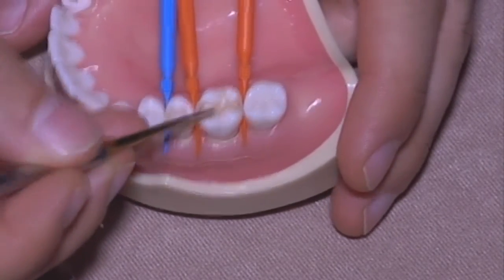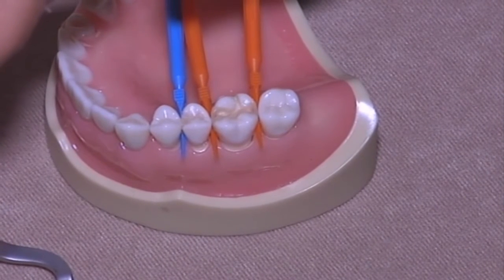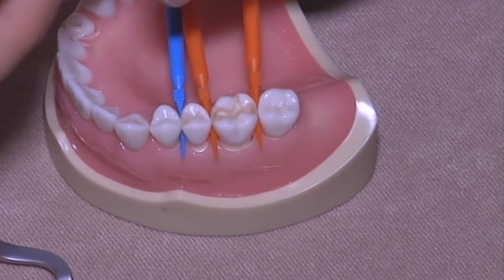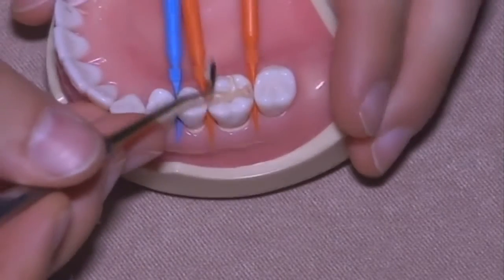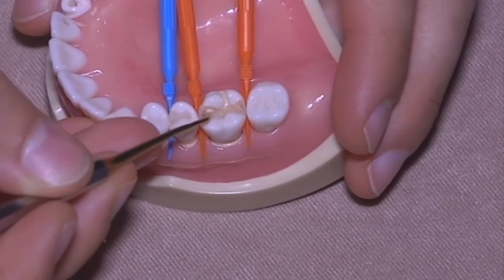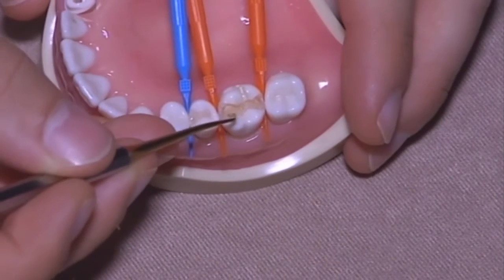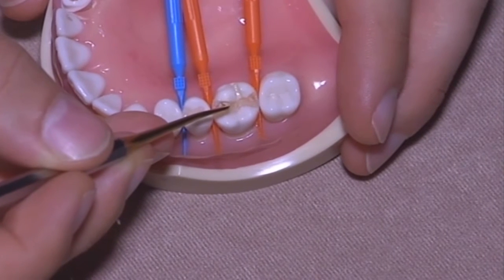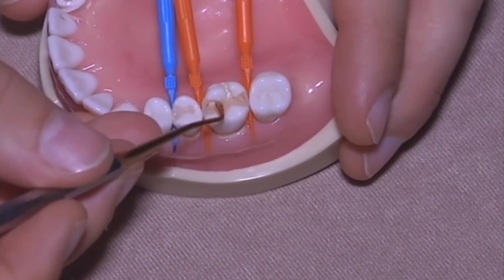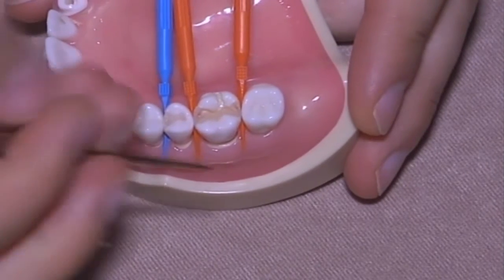The other attention you have to pay is in having the composite touching one wall only. If the composite touches the opposite wall, you are not solving or limiting the problem of contraction stress on the posteriors.